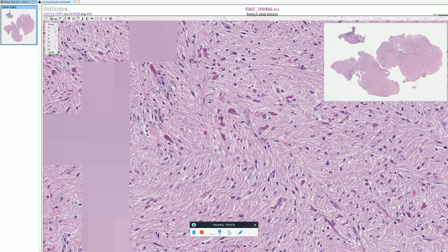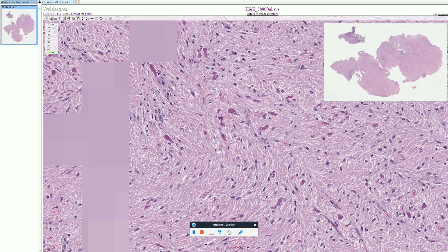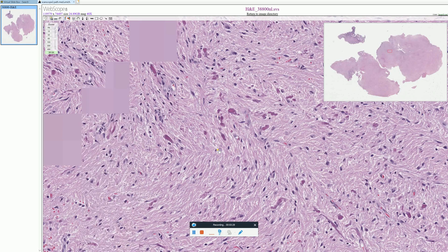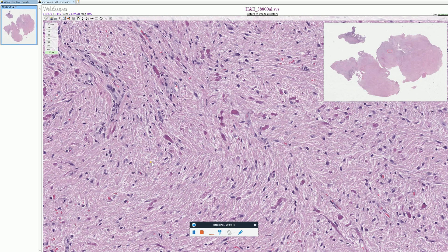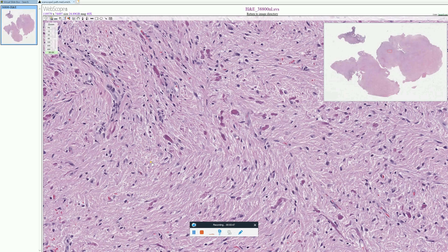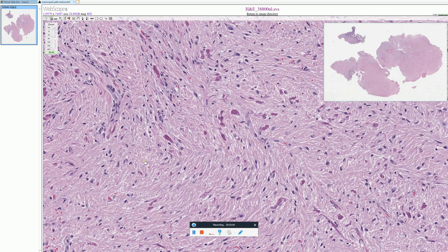Pilocytic astrocytomas can have a variety of appearances. Sometimes they can be more microcystic, sometimes more fascicular, sometimes densely compacted, and sometimes they have alternating regions of dense fibrillarity alternating with more loosely arranged microcystic areas. They can have a variety of appearances, but one of the very common abnormal findings you see in pilocytic astrocytomas are Rosenthal fibers.